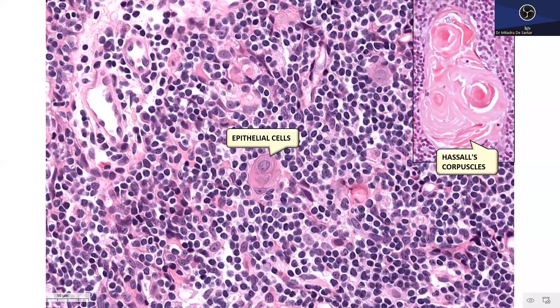The larger polygonal epithelial cells look almost squamoid but, unlike usual squamoid cells, they don't show intercytoplasmic bridging. With increasing age, these epithelial cells become more prominent, clustered, rounded, and polygonal with evidence of keratinization at the periphery, giving rise to Hassall's corpuscles. In an older adult thymus, the cortical zones involute and there is a more prominent proliferation of the medullary zone with florid Hassall's corpuscles.